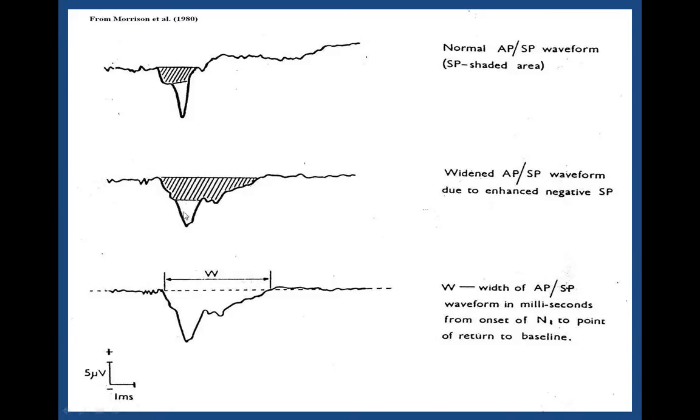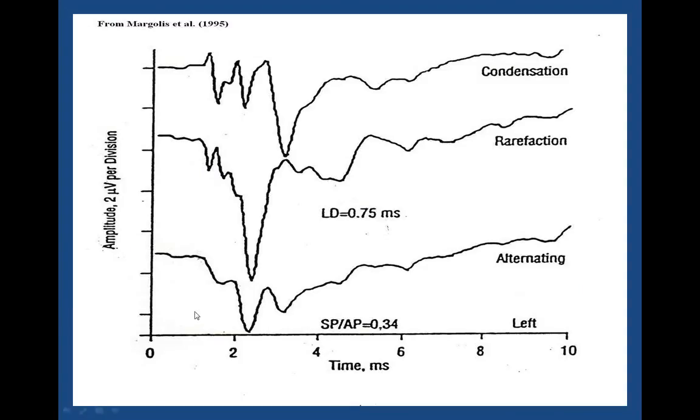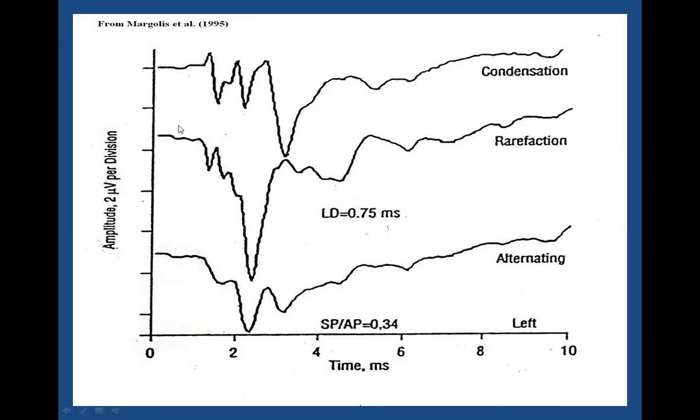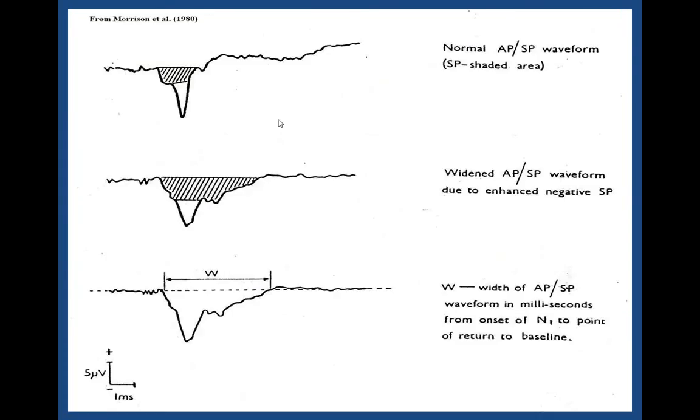And so if you look at this waveform here, and you come back and look at this waveform here, they look very similar. The idea that the cochlear microphonic produces an after ringing, or that the membrane becomes more elastic or looser, if you will, in response to hydrops, has never been verified. But my suspicion is, since they were using alternating clicks, that they were really looking at what Margolis found, the addition of two phase disparate N1s, which makes the duration of the complex look wider.